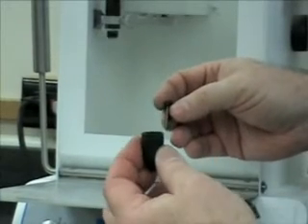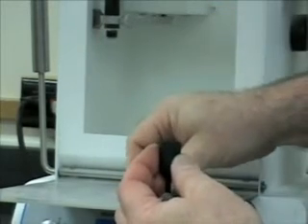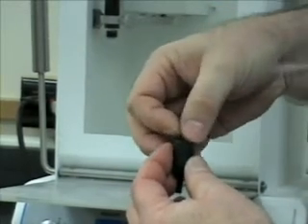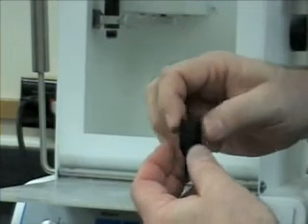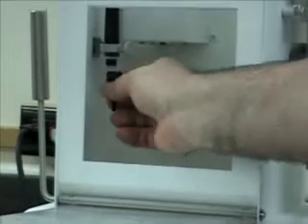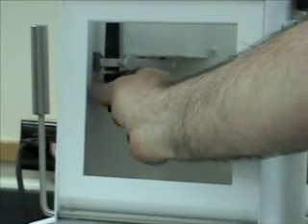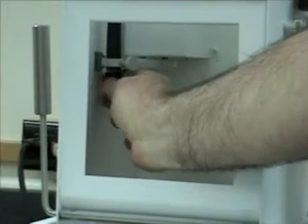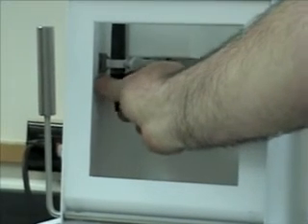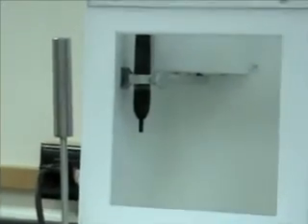The housing, grasp that, place the tip in first, and then place the O-ring on top of the tip, not the reverse. You don't want to put the O-ring in underneath the tip. And then simply reinsert and screw the housing back onto the wand. And give it just a bit of a snug there, okay? And that's it for the tip maintenance.